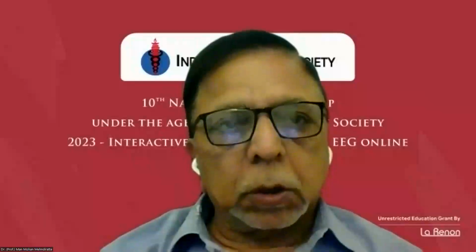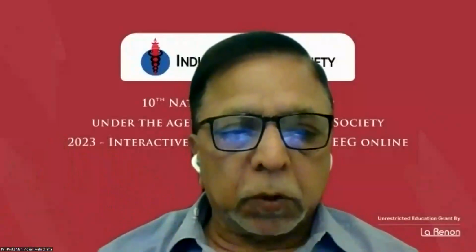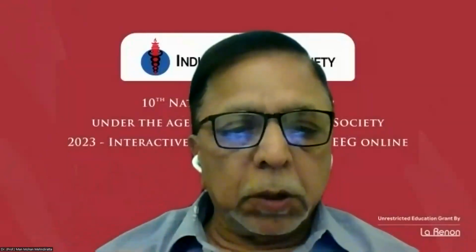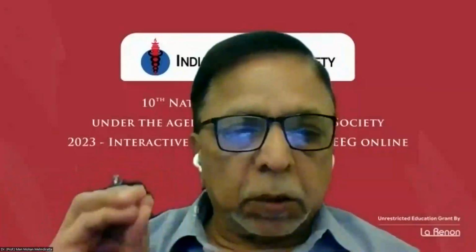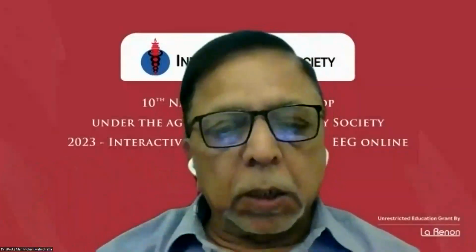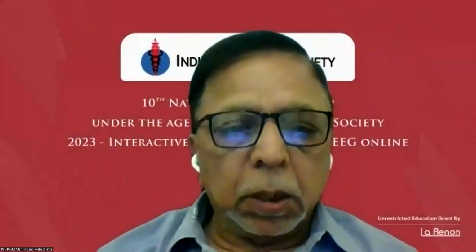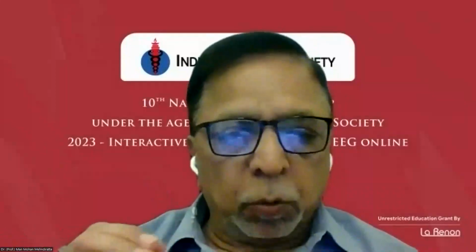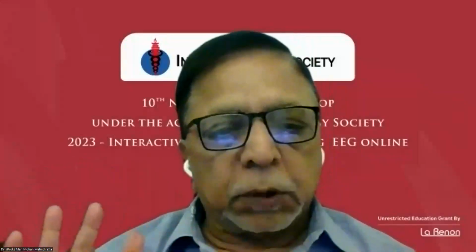Sandor, one more question. Yes. First is a high index of suspicion, second is diagnosis, and then what is the therapeutic objective? Is it disappearance of epileptiform discharges? Second is suppression of epileptiform discharges, and the third is clinical improvement. So what are we really looking for? Suppose the epileptiform discharges disappear, is that sufficient?